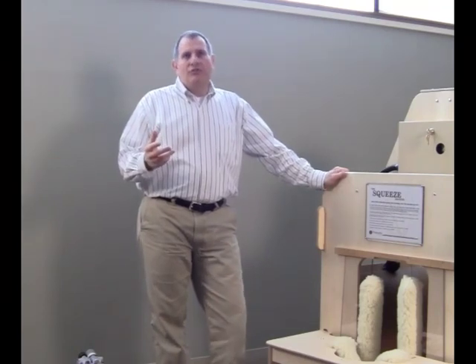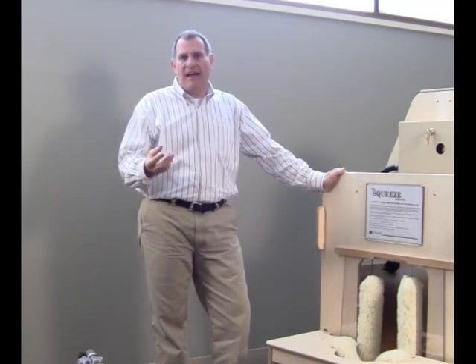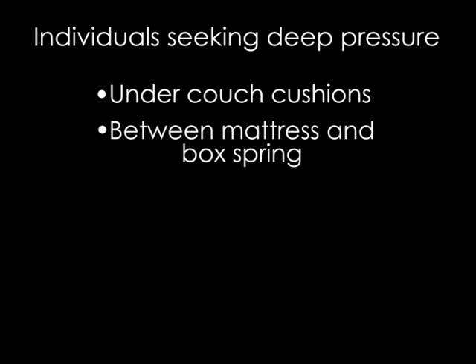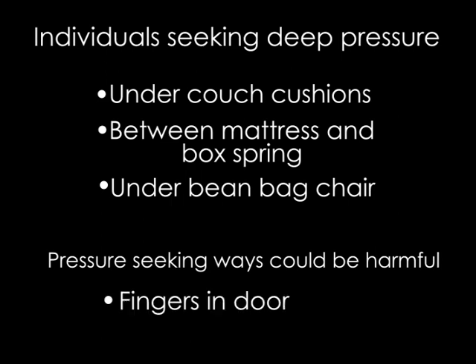For individuals who may use the squeeze machine, I want to talk through some characteristics that might help you decide who is a good candidate to use the machine and who's not. If you see an individual who craves deep pressure, that is, if they get under the couch cushions, if they like to get in between their mattress and their box springs, if they like you to sit on a beanbag on top of them, or if they crave deep pressure in ways that are really self-injurious. I've seen individuals who want to put their fingers into the cracks of doors and various things that really harm them physically. They're seeking out that pressure. They're great candidates for the squeeze machine.